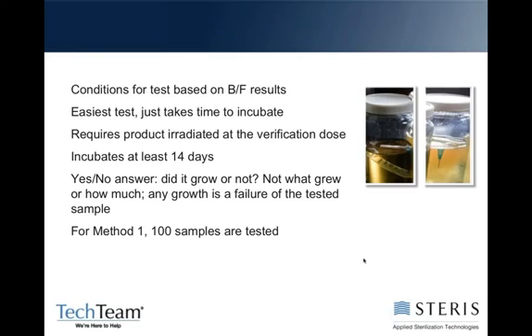That should be sterility on top of that slide, so I apologize for the title being missing. The conditions for the test of sterility are based on the results of your BNF test. This is one of the easiest tests you're going to do. A lab is going to take your product after it's been irradiated, put it in media, and incubate it for 14 days. It's a yes-no test.